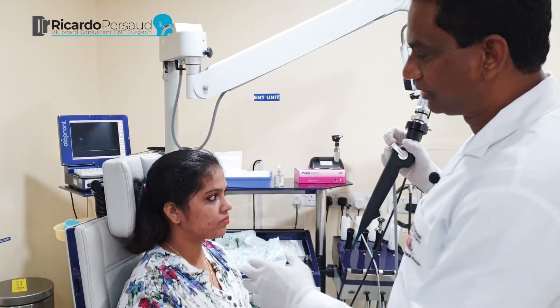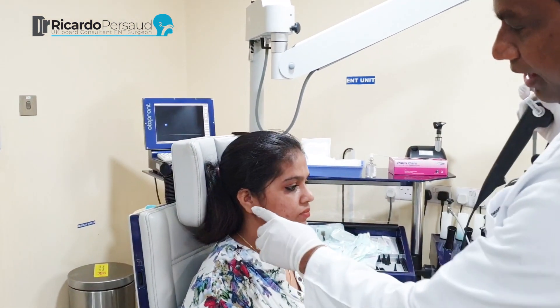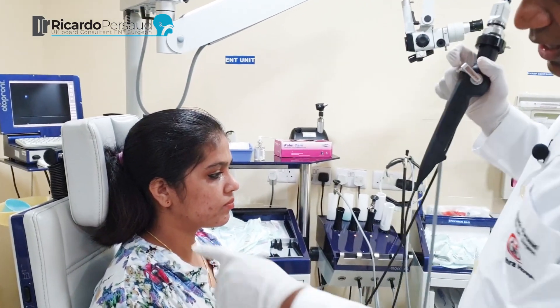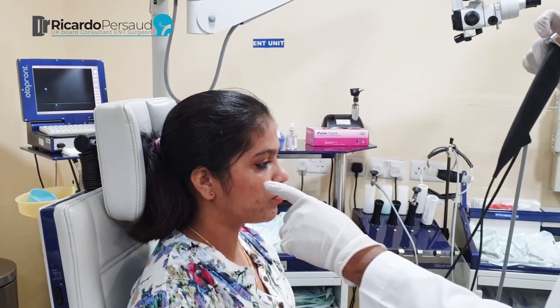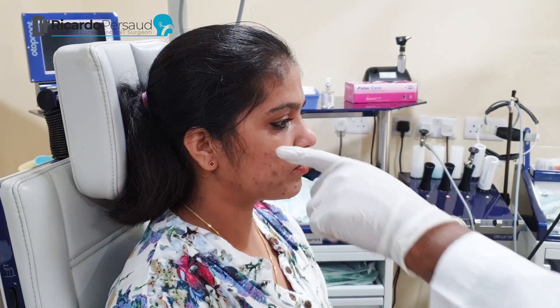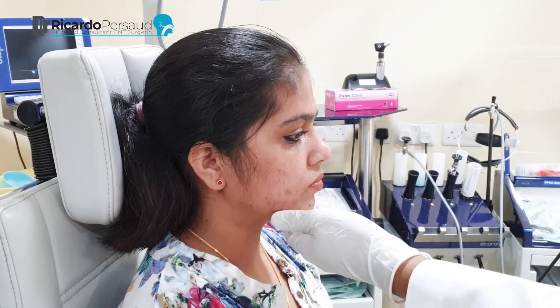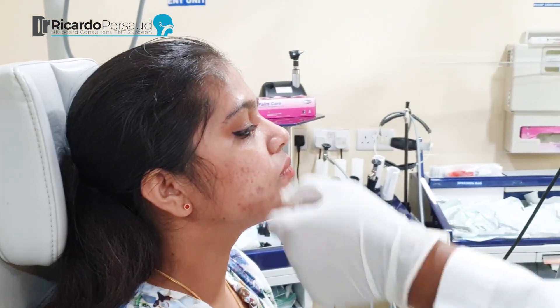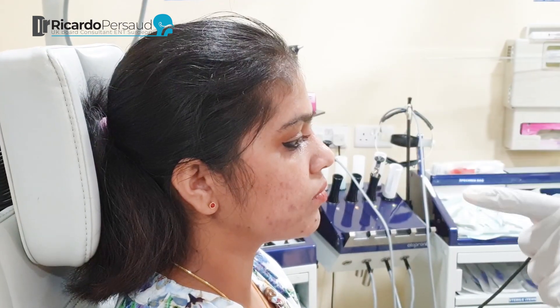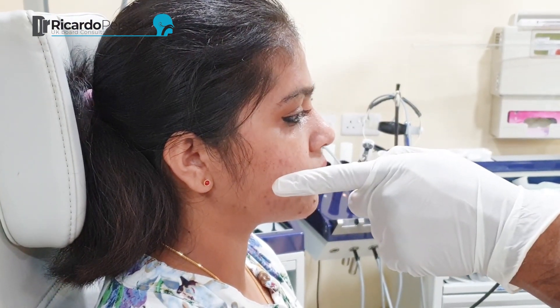So first of all, you must have your patient sitting upright. The way to know that your patient is in the correct position is if you draw a line from the tragus to the inferior margin of the orbit — it should be a horizontal line parallel to the floor. You don't want the patient's head tilted like this or like this. It should be straight, because the nose is actually horizontal and the opening is horizontal.